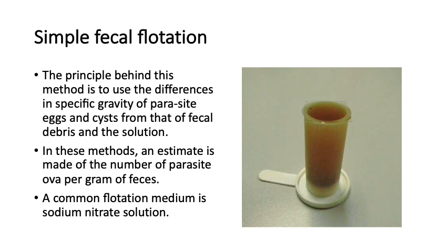There are several types of fecal flotation solutions that are used as a semi-quantitative method of evaluating a fecal sample. A fecal sample is mixed with a flotation solution consisting of various salts or sugar added to water to increase its specific gravity. Parasite eggs and cysts float to the surface, while most fecal matter sinks to the bottom. Other popular solutions include Sheather's solution and zinc sulfate.